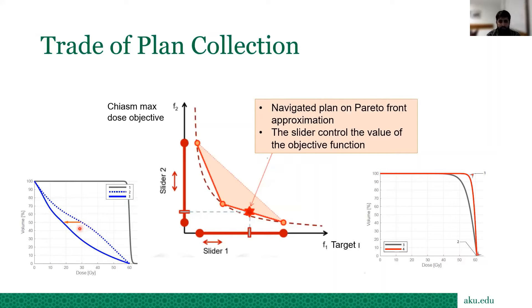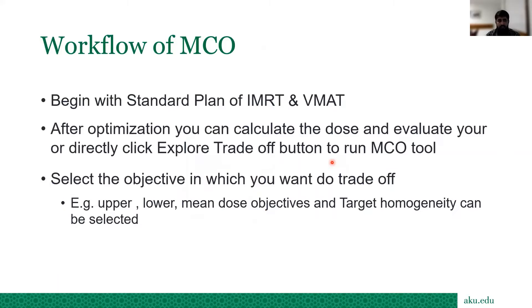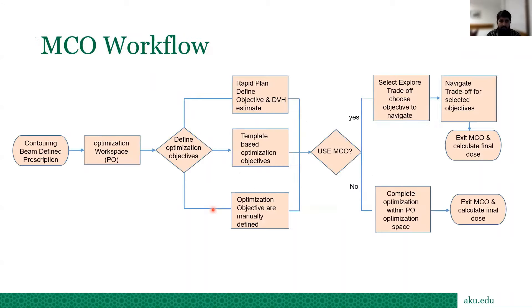In most cases, the maximum OAR reduction is around 20 to 30 percent. This is what we expect from the target, and this is how we get the best quality plan. The MCO workflow begins with a standard IMRT or VMAT plan. After optimization you can calculate the dose and evaluate your OARs, or directly click the 'Explore Trade-off' button to run MCO tools and select the objectives you want to trade off — for example upper, lower, mean dose objectives, or gEUD, and target homogeneity.